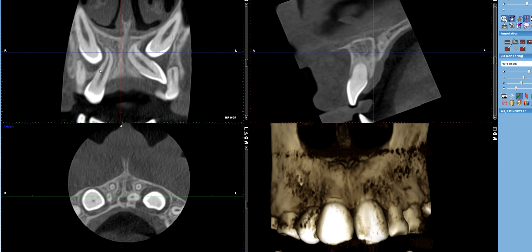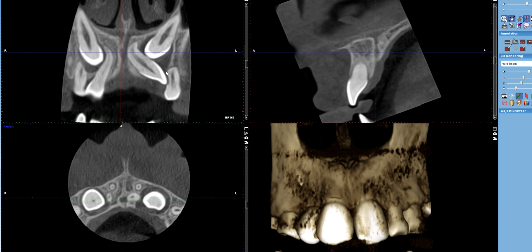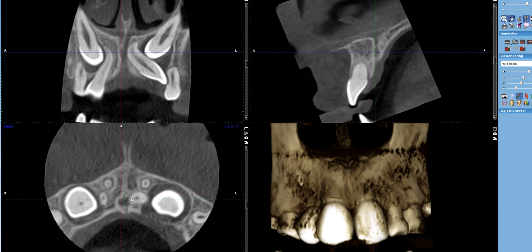What's interesting here is that I don't see any overt evidence of root resorption, but you can see the degree of root dilaceration — the bending. It's probably related to this impaction and the way this tooth has been forced to erupt as a result of this canine. It mechanically makes sense that when force is directed this way, the lateral is forced to come out in this direction, resulting in dilaceration. The same is true on the left side as well.